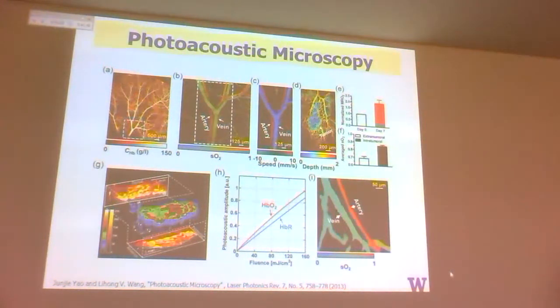But why this has gotten some excitement is you can do this wavelength selectivity, to move the wavelengths around to remove labels, so not to have to use labels for trying to identify biomolecules. That's number one. Number two is, this is simple, because you don't need these huge powers, so you only penetrate a millimeter. So the actual energies you need, focusing with optics, are relatively modest. And so you can use very high rep rate, low power lasers to be able to do this.